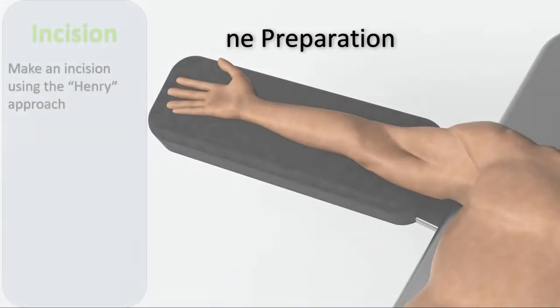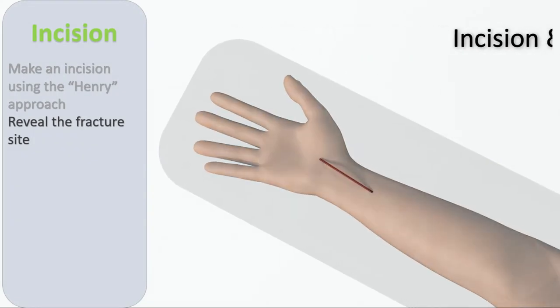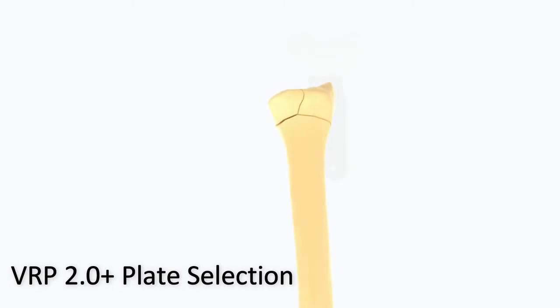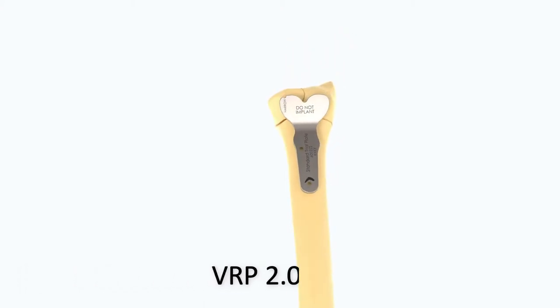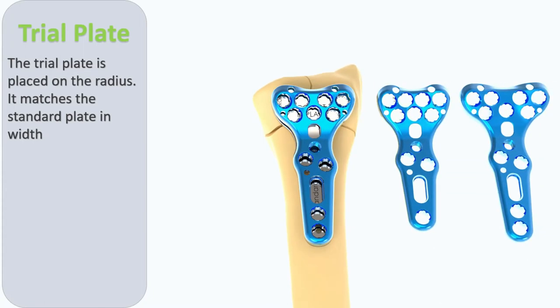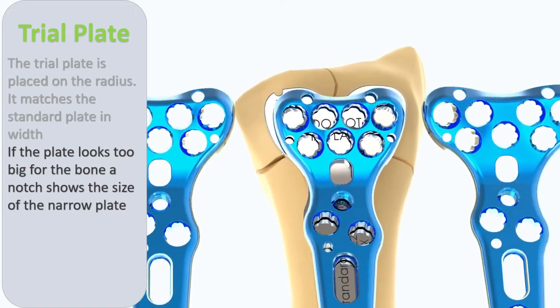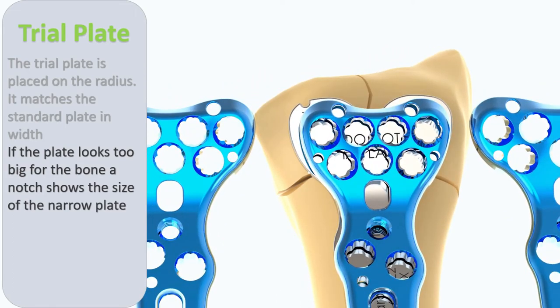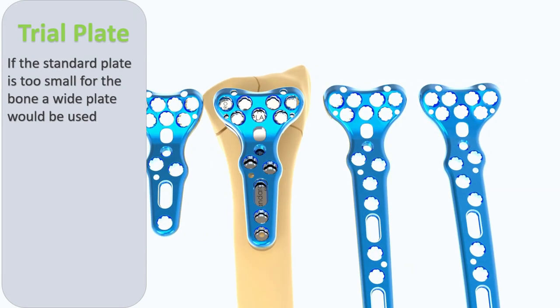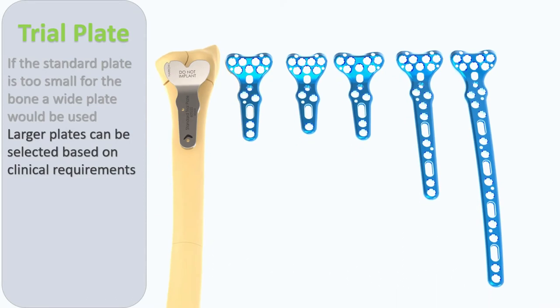The distal radial fracture is approached through a standard FCR approach. Once the fracture has been demonstrated and a provisional reduction achieved, a trial plate is used to determine whether a standard, wide, or narrow plate is optimal for fixation. Although the standard length plate is suitable for most distal radial fractures, certain fracture types require a longer plate, available in two additional length sizes.